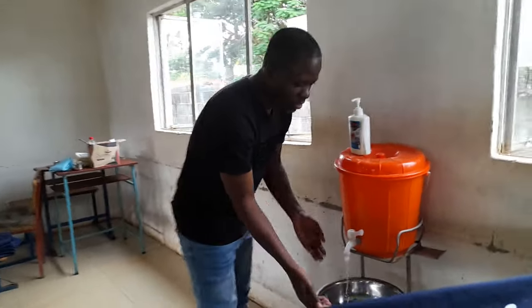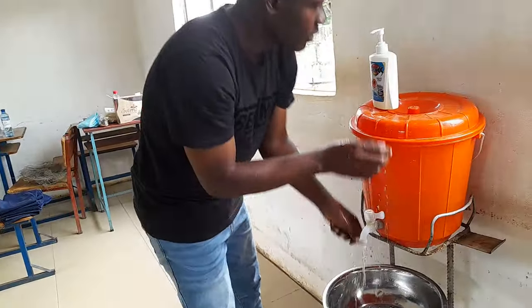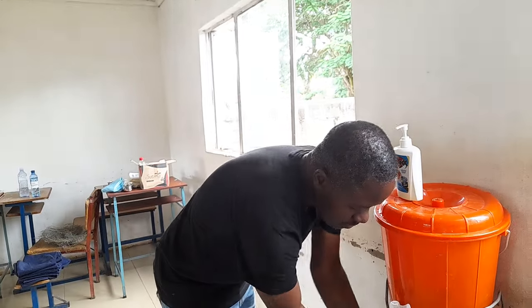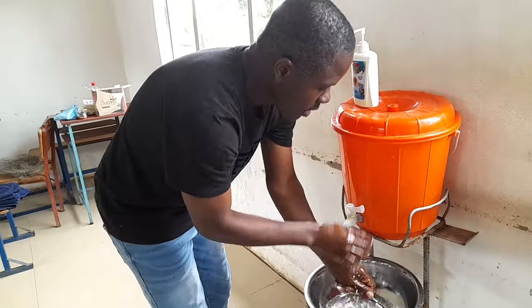As usual, we start with hand washing. This is just a brief wash — you put soap and do it once since it's for prep. Otherwise, do a full hand wash.